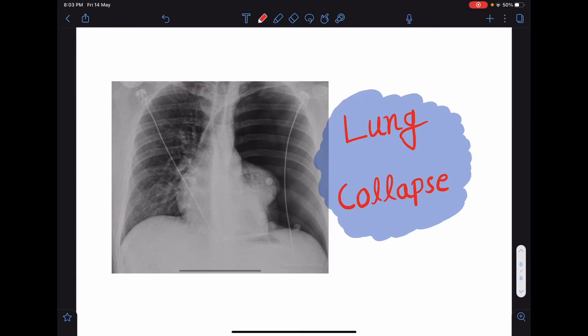Hello everyone, this is Dr. Sangeeta Chaudhary and I welcome everyone to my lecture class again. In today's lecture class, I am going to talk about lung collapse. We are going to learn what is lung collapse and how a lung collapse will look like in a chest x-ray, what are the causes of lung collapse, and how we can differentiate collapse and consolidation from a chest x-ray.